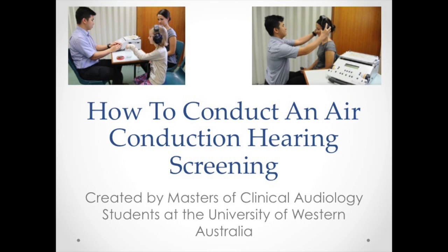In this video we'll discuss how to conduct an air conduction screening using an audiometer. We discuss how to assess children over two and a half years old using play audiometry and clients over five years old using pure tone audiometry.